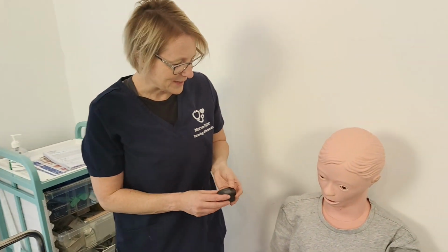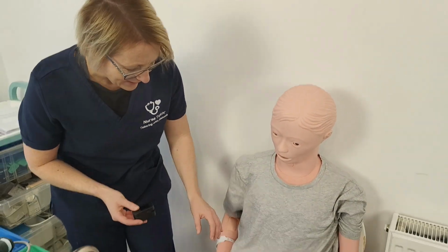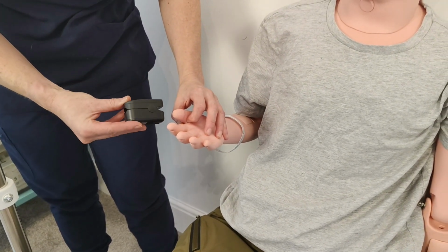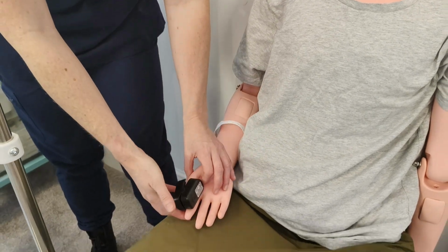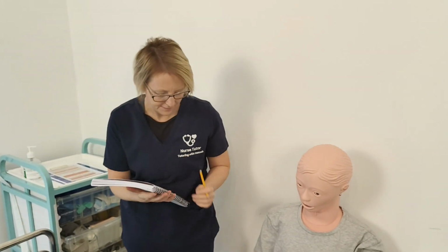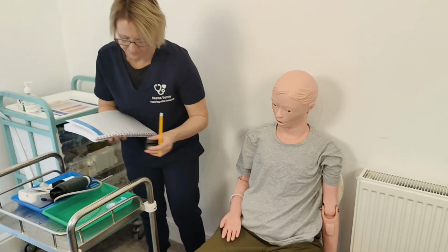Now I'm going to move on and record the oxygen saturation levels. Rose, I need to put this probe on your finger. Do you have a preference for which hand? Okay, thank you. I'm going to check your finger here, and I can see that it's clean, there's no nail varnish, and I'm happy to put the probe on. I'm going to turn that on and place it onto the thumb, and let that settle and read. I'm just going to jot down my respiratory rate of 25 and my oxygen saturations, which are 96%.